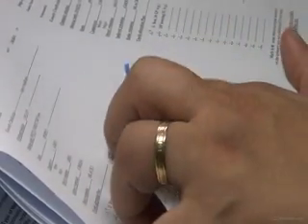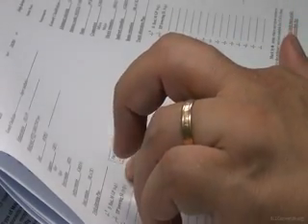Page 3, let's design. Here we have 4 rests on each abutment. So these are stable, there are no rotations, because if I place, this is a fulcrum, if you can see it on the screen, okay? If these 2 rests are rotating around, this is my fulcrum line around rotation, this rest will prevent it, and this rest will prevent it. This is the most stable design.